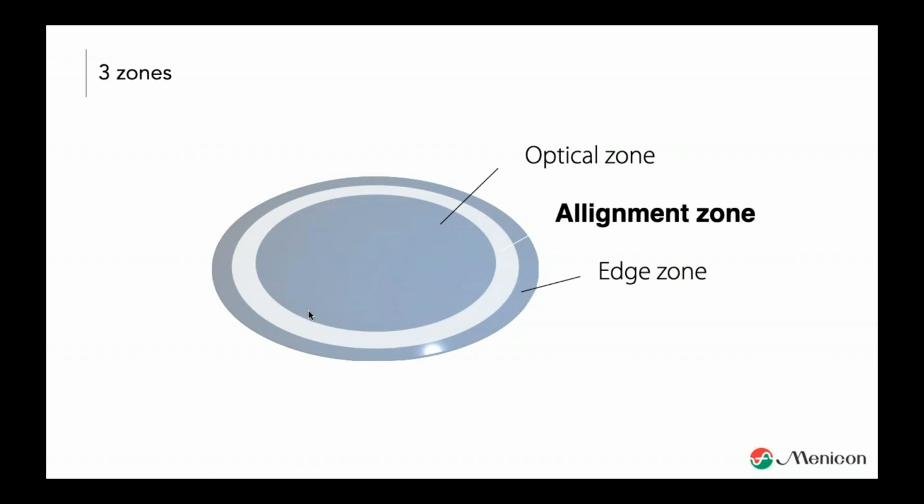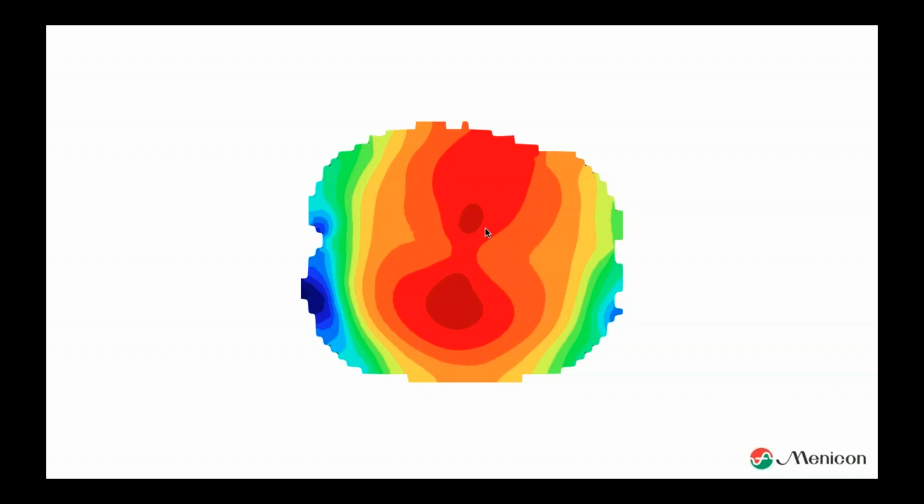So if you have your map and you only use the center area for the K readings, but in fact the lens is fitting in a totally different area, well, we do a very rough estimation. We are guessing more about the fit than we actually fit the lenses. So what we're doing these days is fitting the lenses on K readings in the center, and we work our way out. And our approach is we have a topographer.